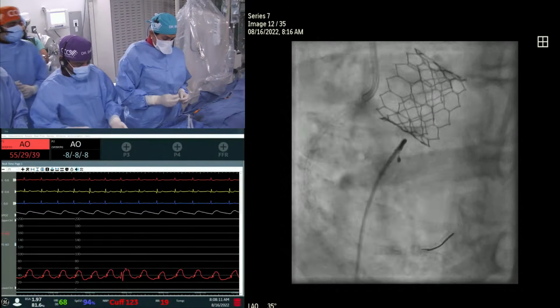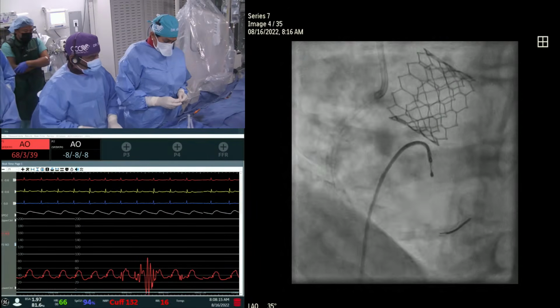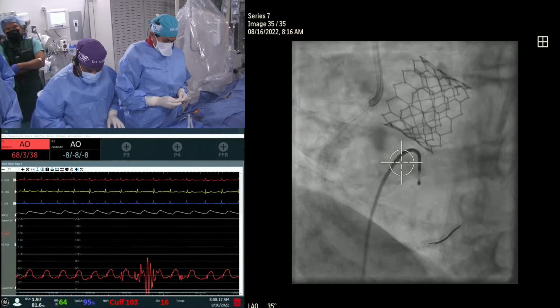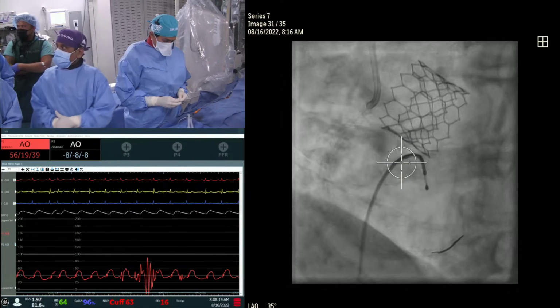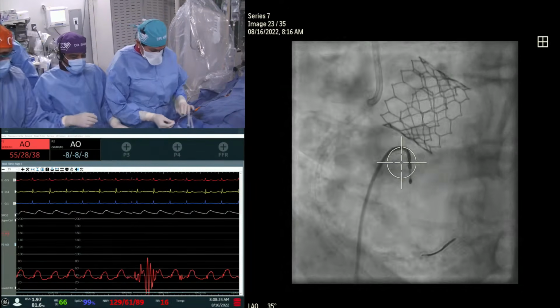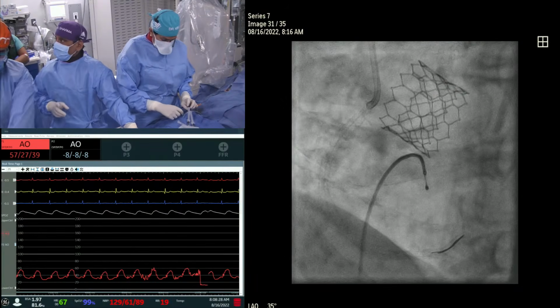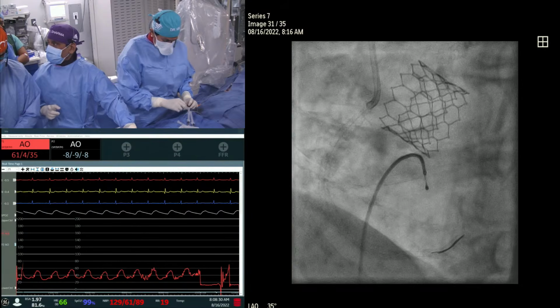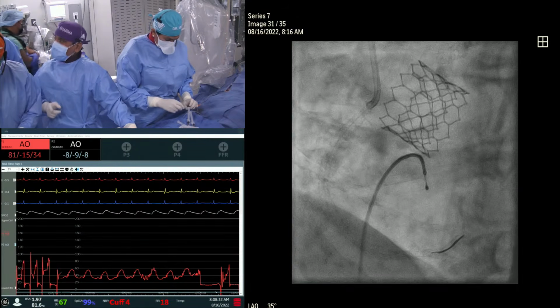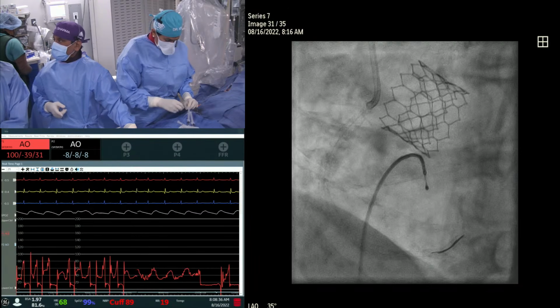No. If I want to do OCT, that's the reason, because we start with OCT. We really wanted to understand the mechanism, and hopefully we'll try to answer this question to our audience. When do you use a rota, IVL or laser in this under-expanded stent? We are not talking about ISR only. We are talking about the under-expanded stent. That's exactly what this patient is. ISR is part of the under-expanded stent, we all know, and that will be part of our discussion also.